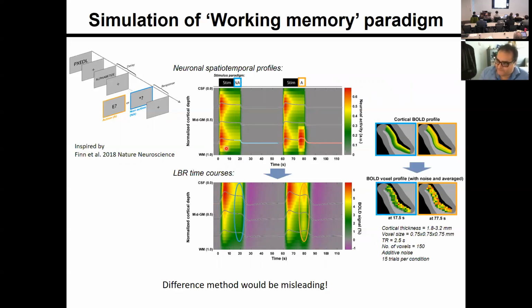And because we have used mathematical equations, we can actually say with confidence the cause of this profile was this profile. But there's no resemblance, which also comes back to my argument that the BOLD signal using the gradient echo approach does not resemble electrophysiology. And using our model, it would be weird if it would resemble electrophysiology.